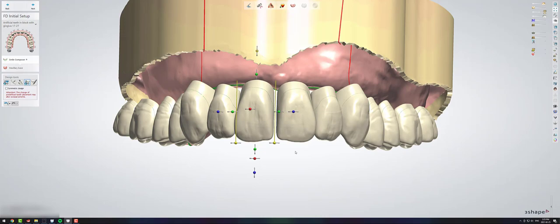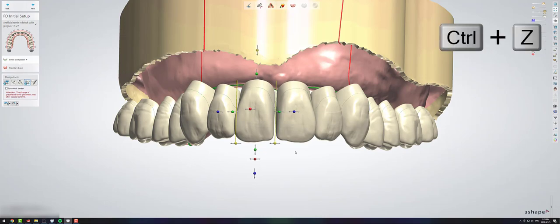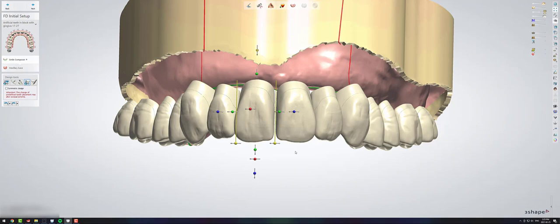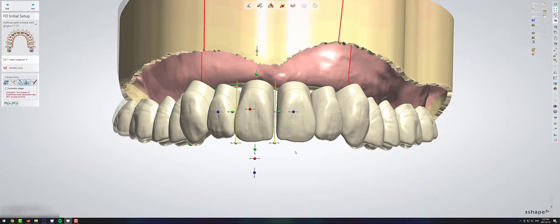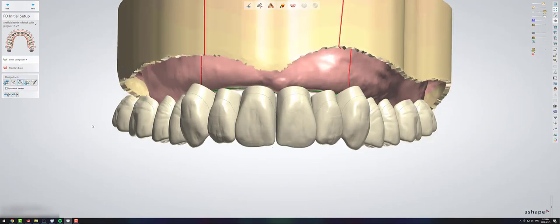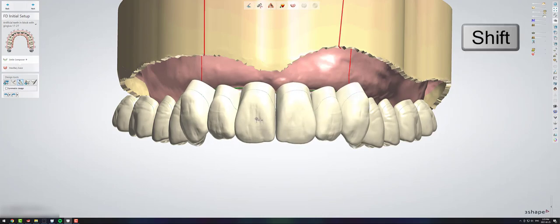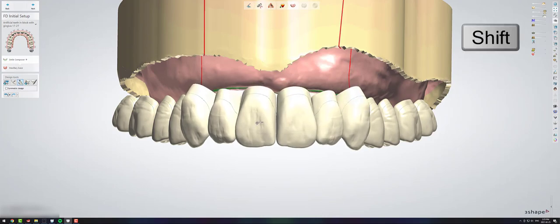If you hold control Z, it will undo anything you've done. And if you want to redo it, you can click control Y and that will redo anything you've done. You can use the symmetrical shift button in almost all of the design settings for dentures.